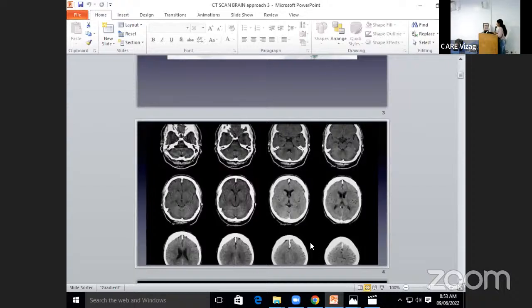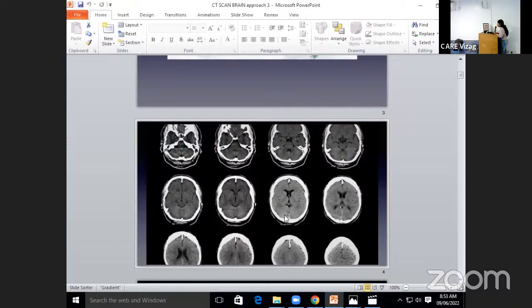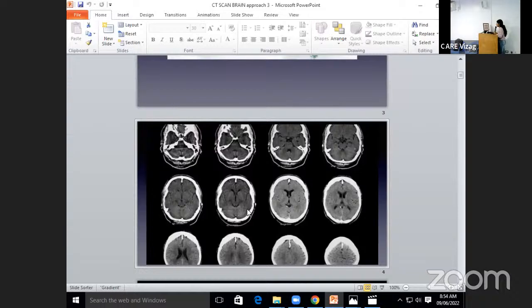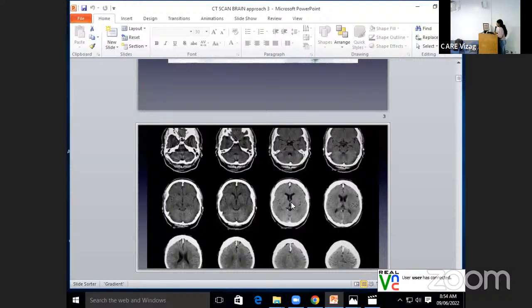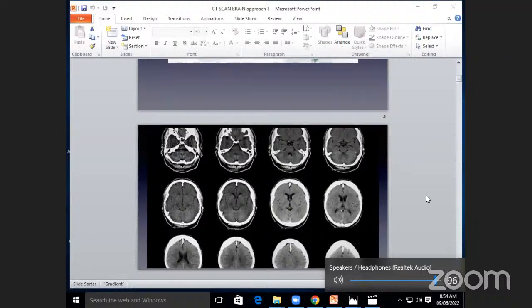Any conditions where we prefer CT or MRI in the initial stages of stroke, if any lesion which you're looking for is not visible on CT, then we would go for MRI. And any demyelinating pathologies which we cannot make out on CT. Any causes of seizures like meningitis, we cannot make out on CT very well.